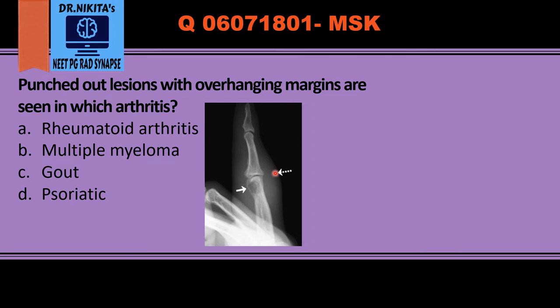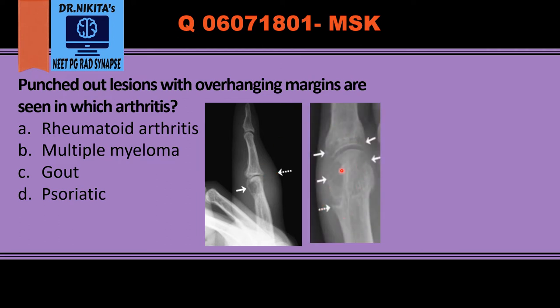Again here we see punched out erosions — punched out lytic lesions. We see that the joint space is preserved. So in gout the joint space is preserved. There is no osteopenia; the bone density is maintained.